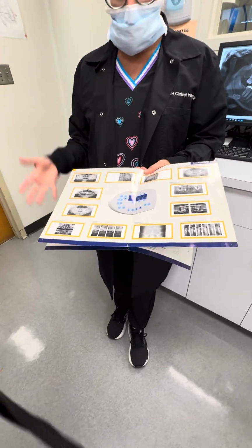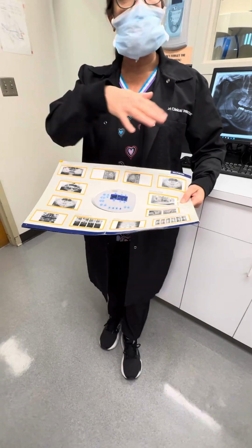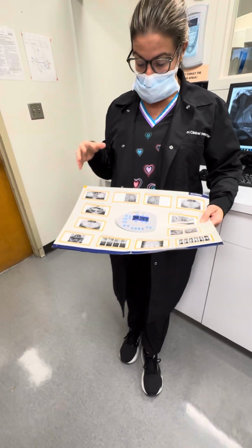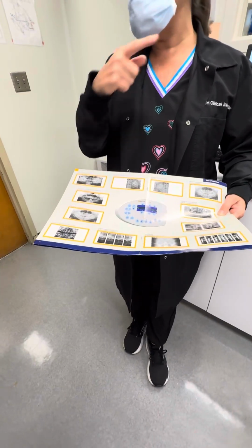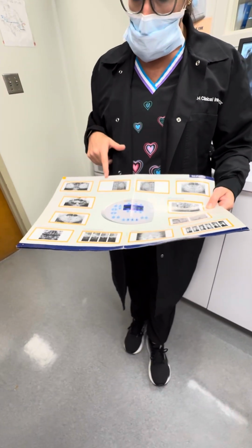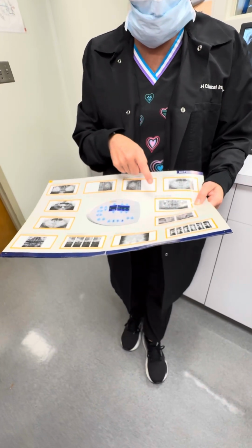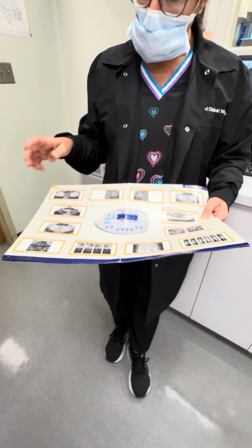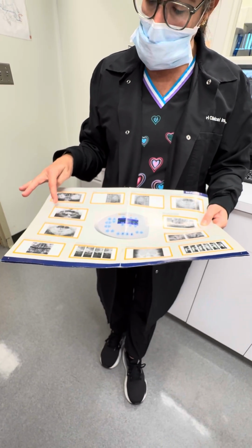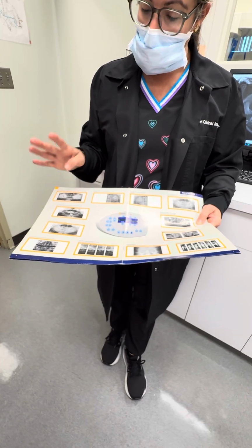Remember me talking to you guys yesterday in lecture about all of the different projections that we can actually do with this particular machine. So P1, that is the standard Pano that we actually use today. You can do a left or a right side. This is one that's artifact free. This is the one that we would do for pedo, so that's the P10. Then we also have a P1C. It's a standard Pano with constant magnification, also ideal for larger patients.